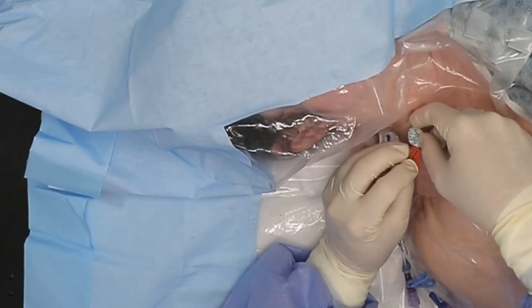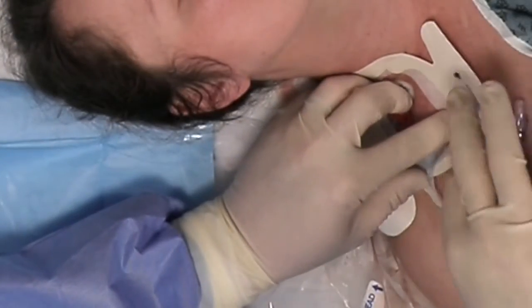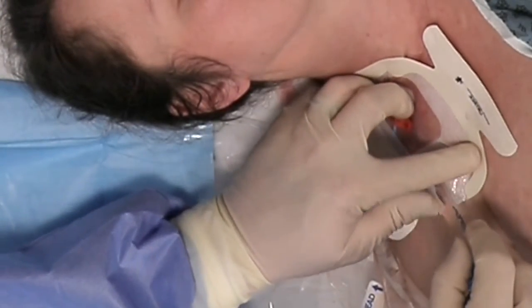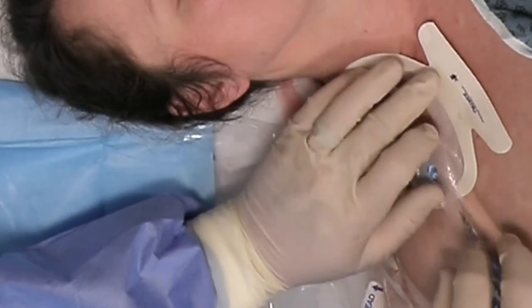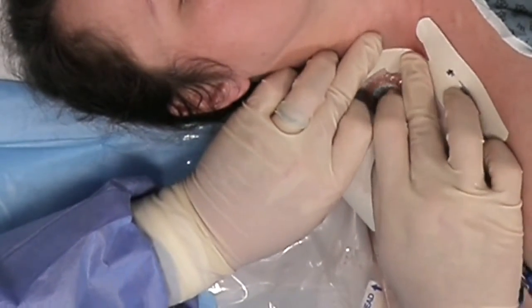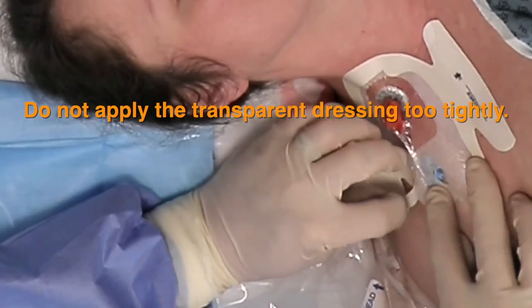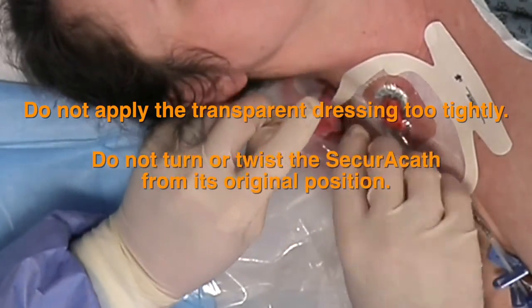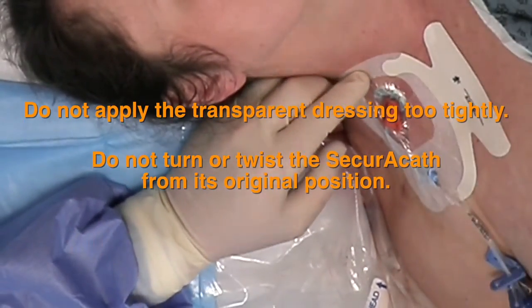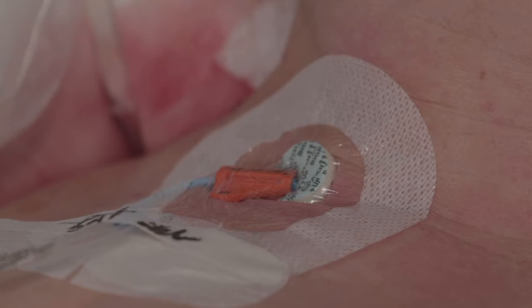Dress the catheter site per your institute's protocol. Let the site dry completely before applying any dressing. The SecuraCath works with all dressings and/or antimicrobial discs. Do not apply the transparent dressing too tightly.